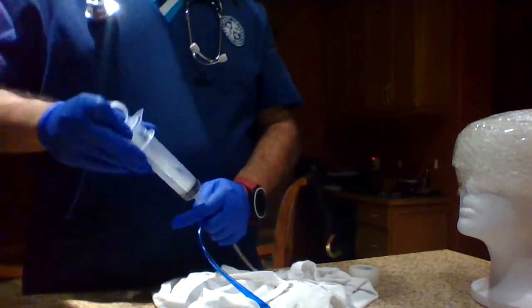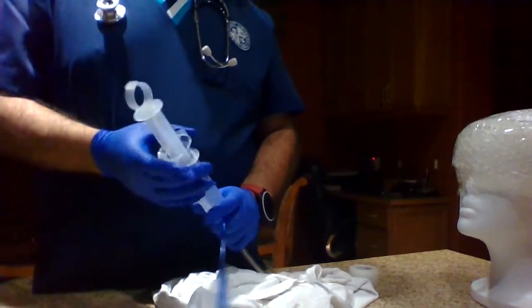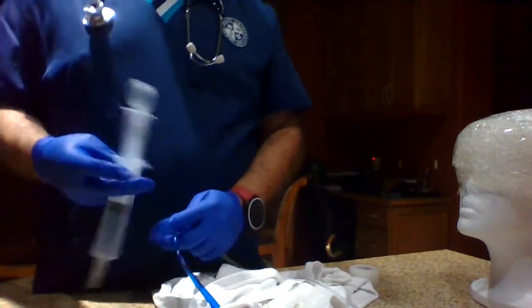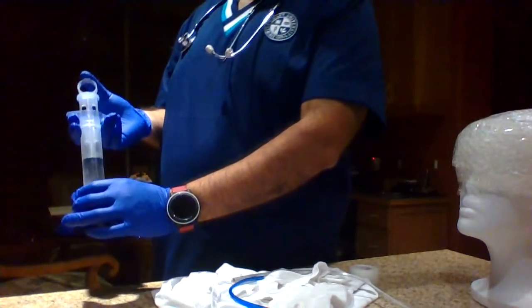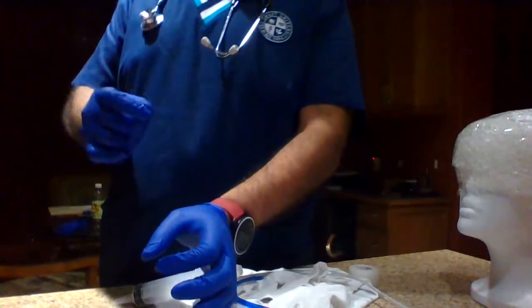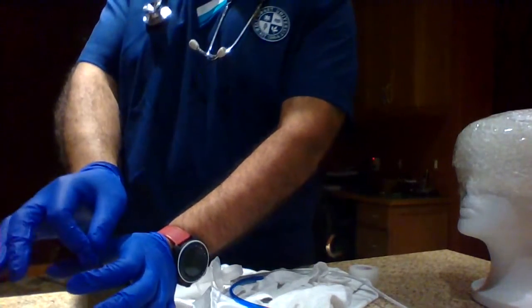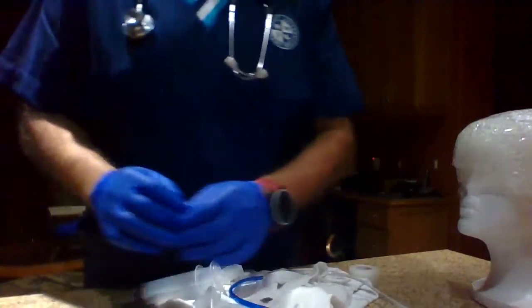We're going to aspirate. You pull, aspirate. You're going to have your container. You put it in there. You get your pH sticks, dip it. You make sure it's in the correct area. If it is, you're good.